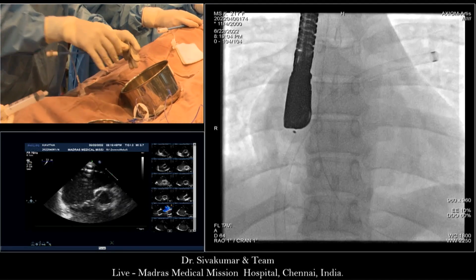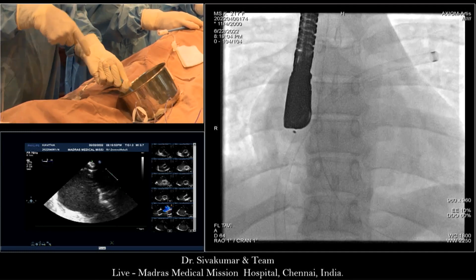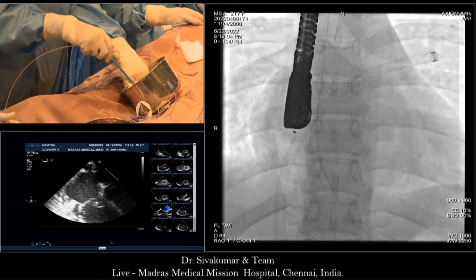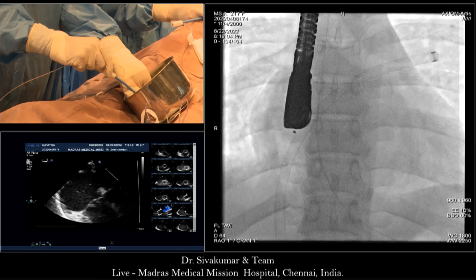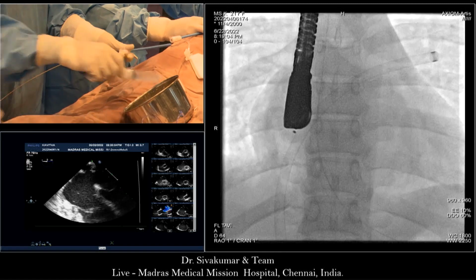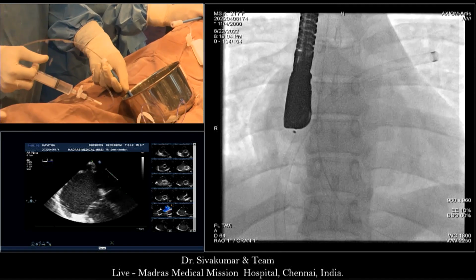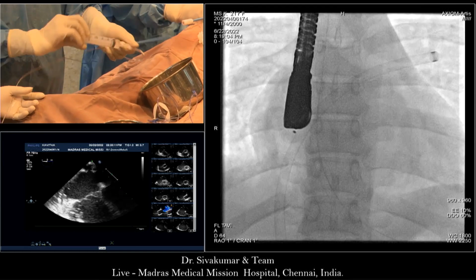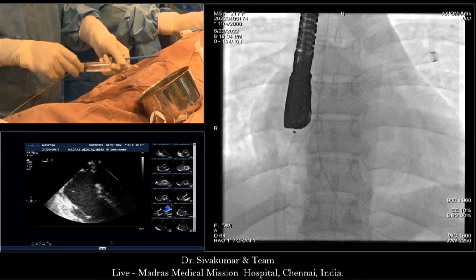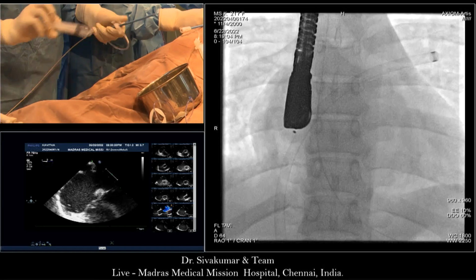Is there any recommendation for using softer devices for the deficient retroaortic rim? Soft is always great, there's no question about it. We can never fight that. But there is a reason Occlutech and Amplatzer come in 1 millimeter increments from 4 to 20, and then 2 millimeter from 22 to 38 or 40 millimeters. Amplatzer wasn't crazy to make so many different sizes. The reason is if you have a self-centering device, you should size it. Don't undersize it, don't oversize it.